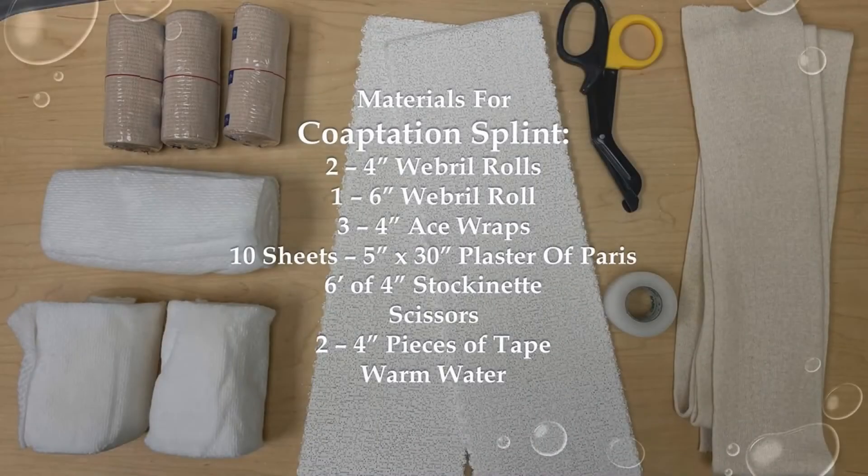Before you begin splinting, gather the materials that you will need. The materials listed here are for an average adult patient. For the coaptation splint, you will need two 4-inch web rolls, one 6-inch web roll, three 4-inch ace wraps, 10 sheets of 5-inch by 30-inch plaster, 6 feet of 4-inch stockinette, scissors, two pieces of tape, and warm water.